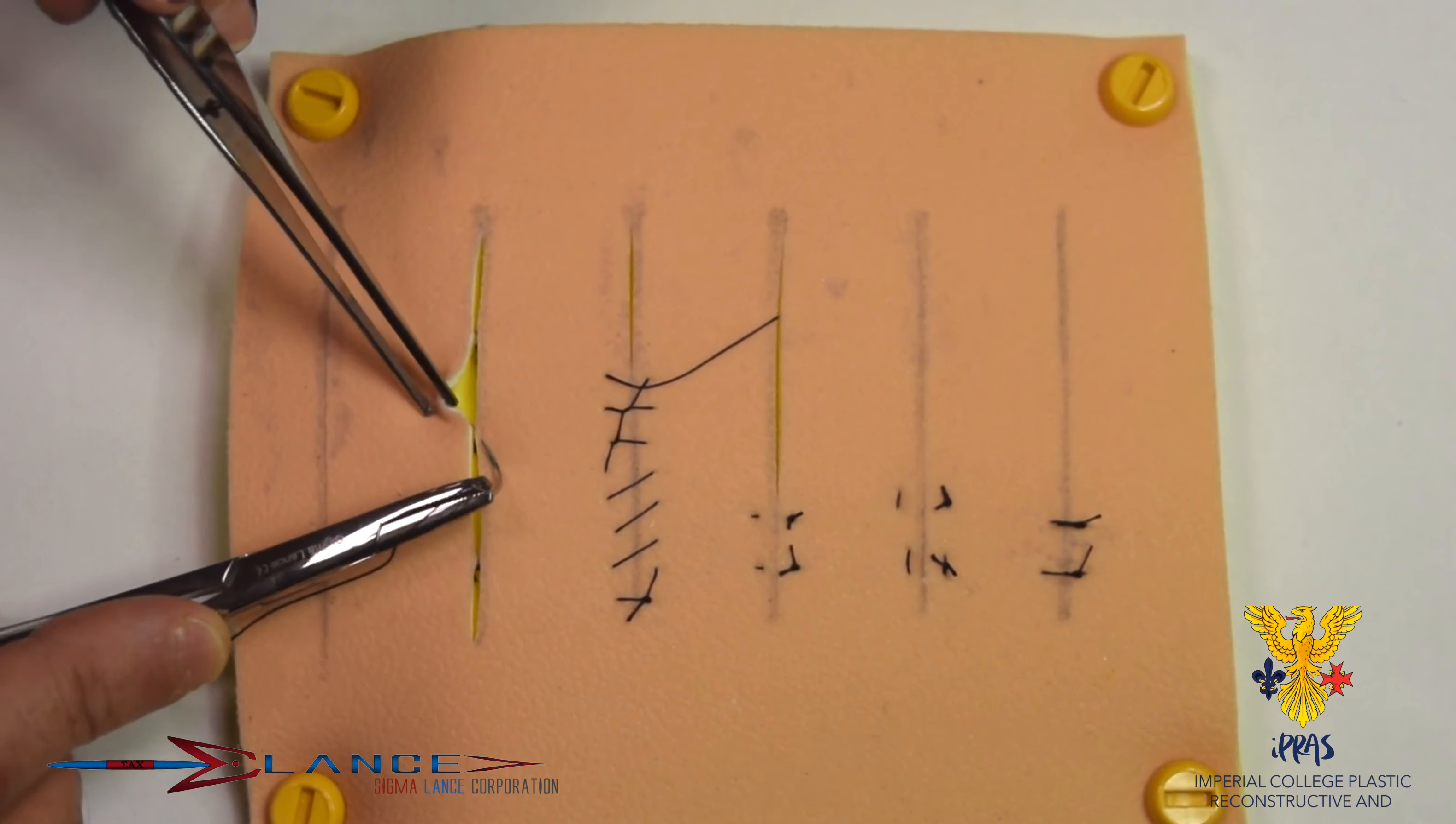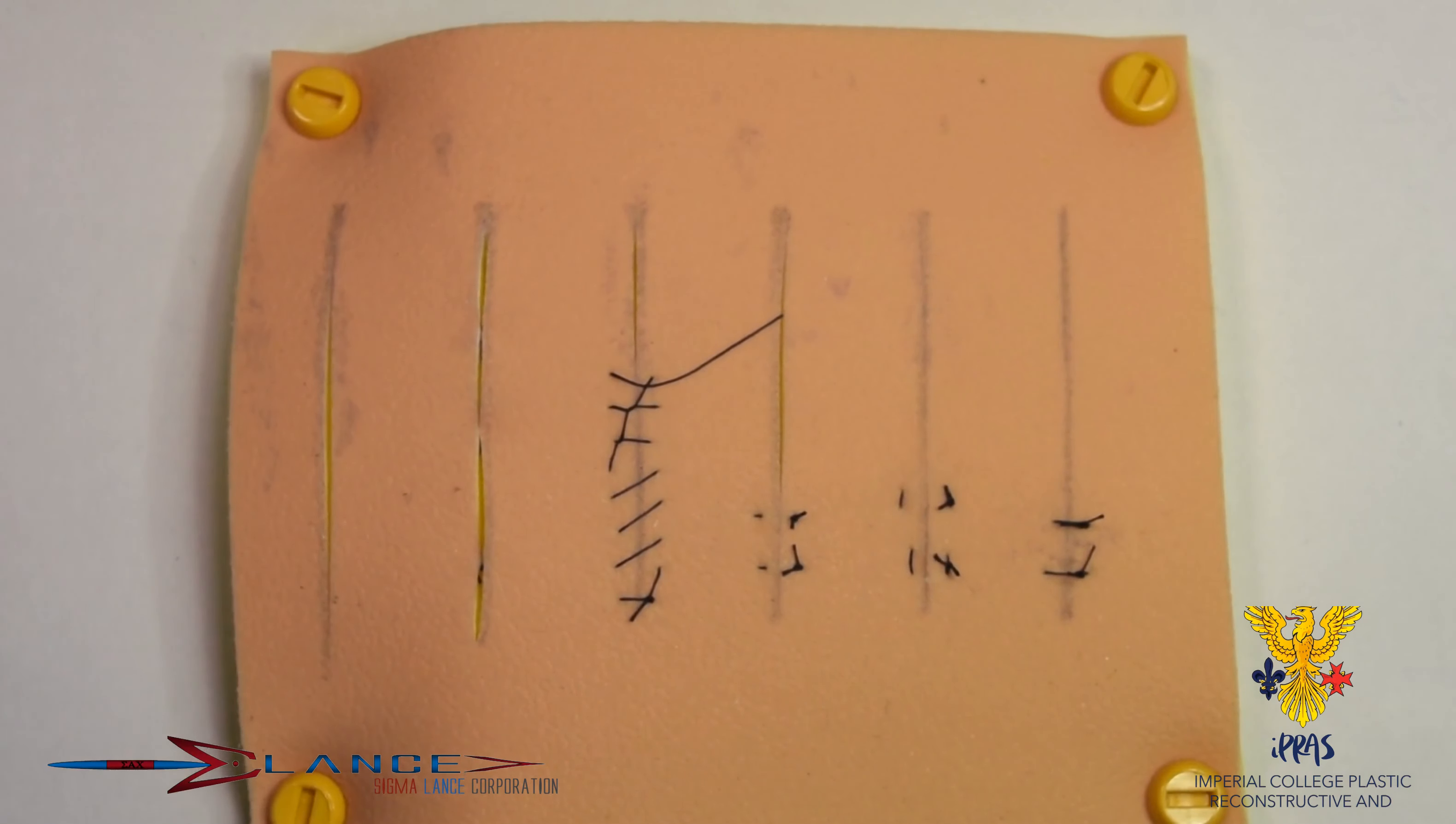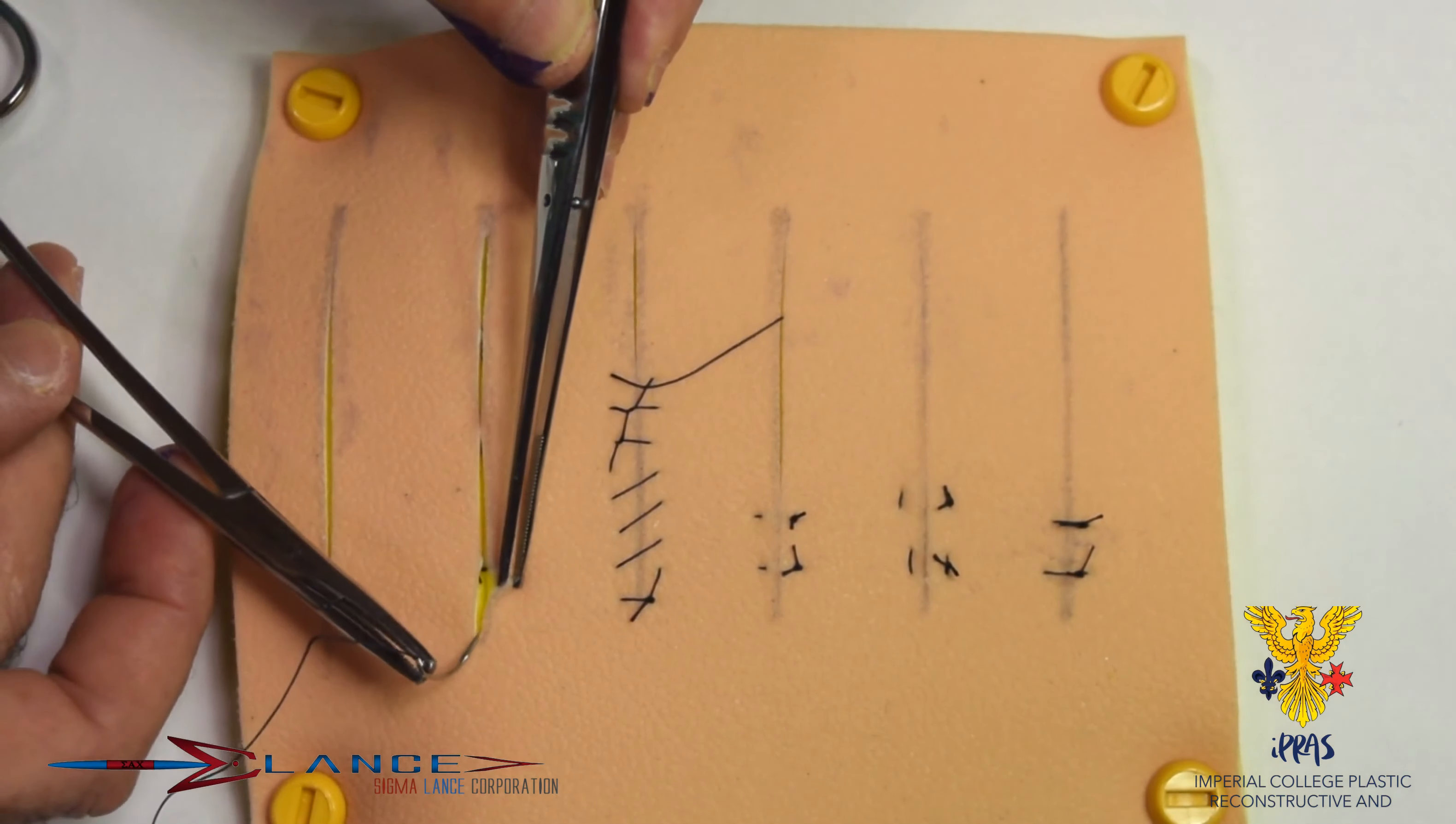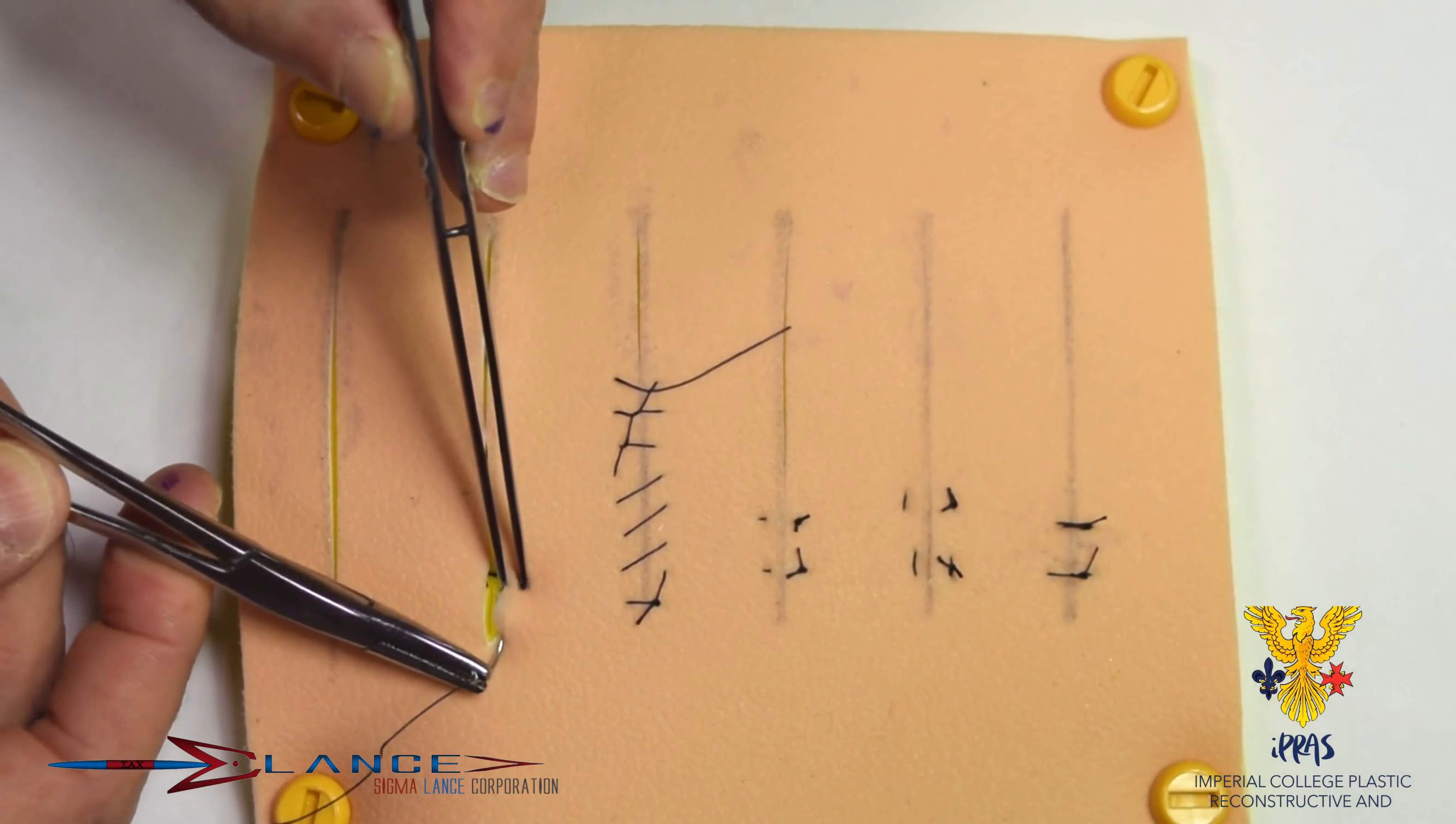I've put interrupted deep sutures in that's brought the dermis together, and so this skin closure now is no longer under any tension. And the subcuticular runs just below into the dermis and begins initially with a securing stitch.